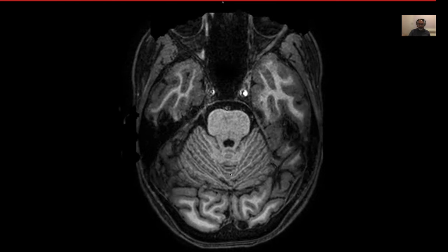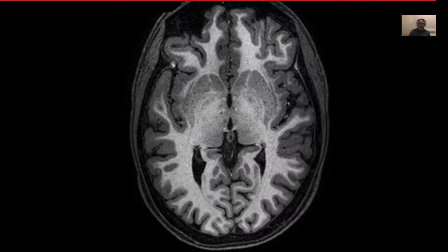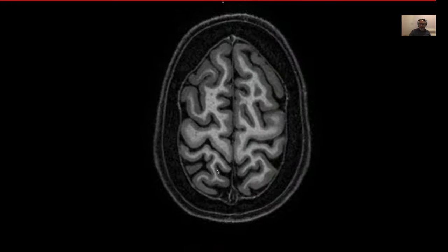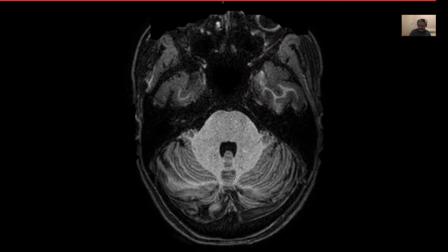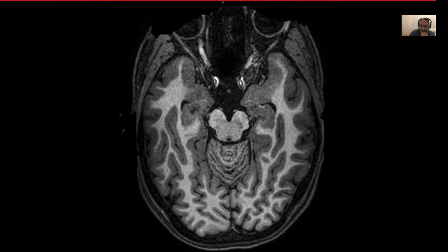I'll move it up again. And what is above that tent is actually called supratentorial. So the brain here and higher up is supratentorial. And that term is used commonly, so this is all supratentorial up till here. And if you go back down and to when the cerebellum starts popping up to the point that it is completely visible, that is infratentorial. So these are just terms used for spaces. So let's just go back. So that's your cerebellum. It pops up.